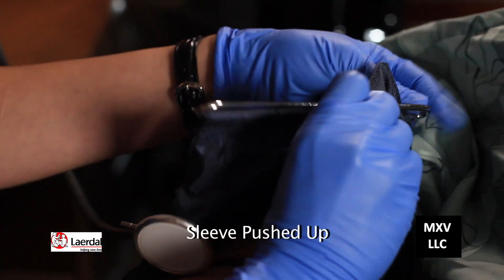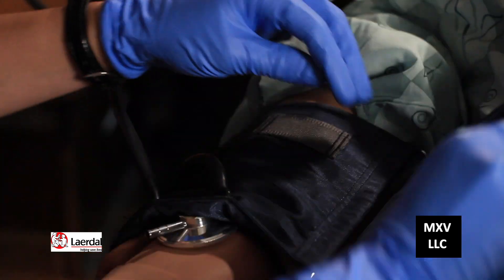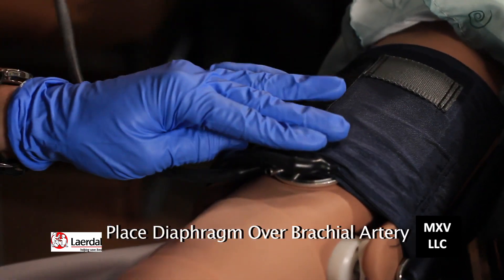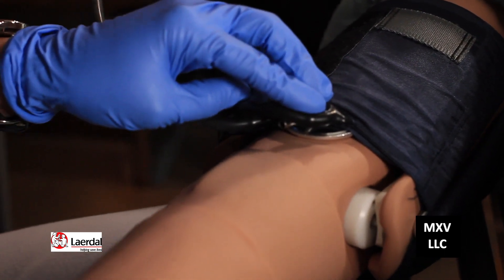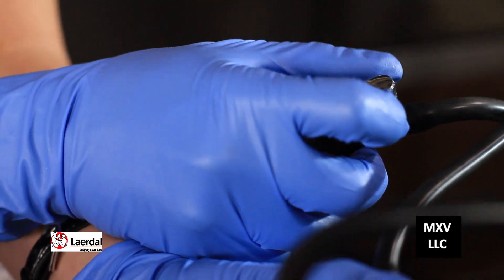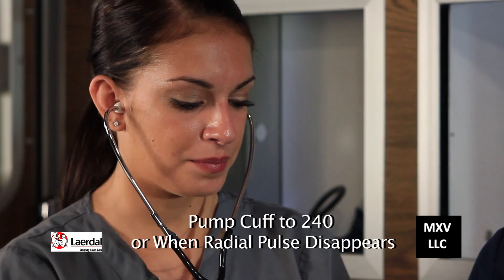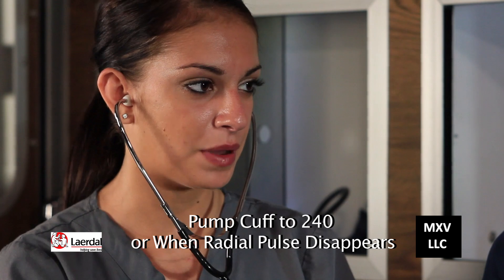We've already cleaned our hands and the earbuds and we have our gloves on. We're going to place the blood pressure cuff onto the arm. Make sure the diaphragm is over the brachial artery, then place two fingers over the radial artery and turn the valve all the way to the right.